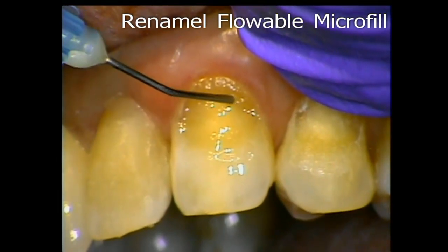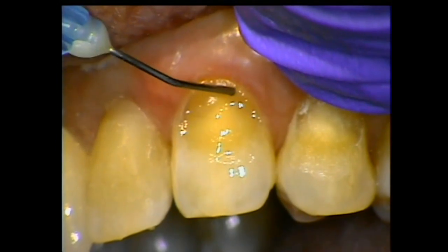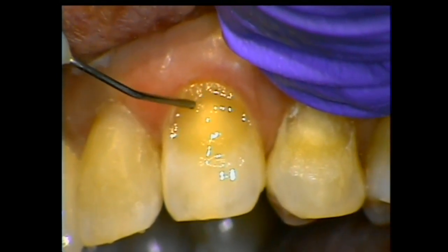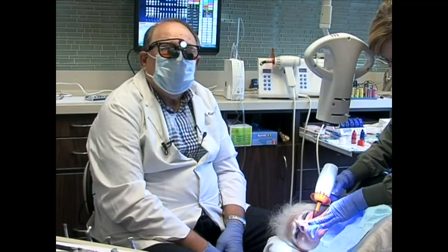And you can see how gently I'm flowing that in. We take it right down to the margin and it stays right where we put it — that's the beauty of this. And once I've done that, then I can add the material over the top easily.